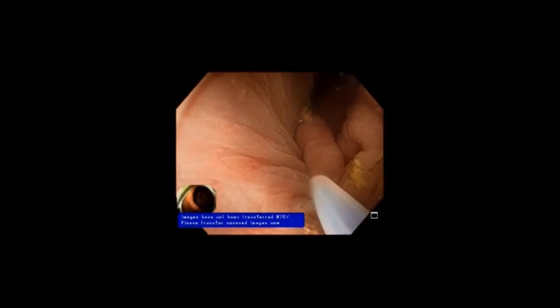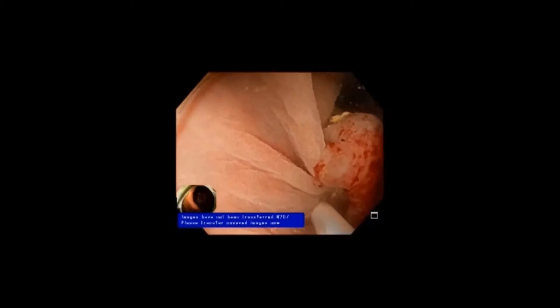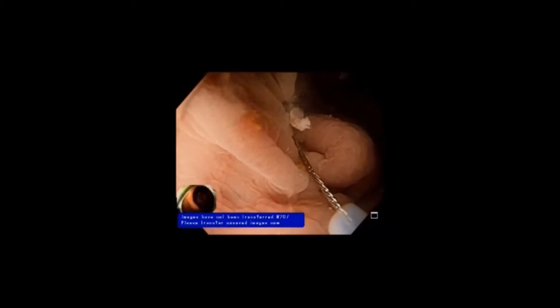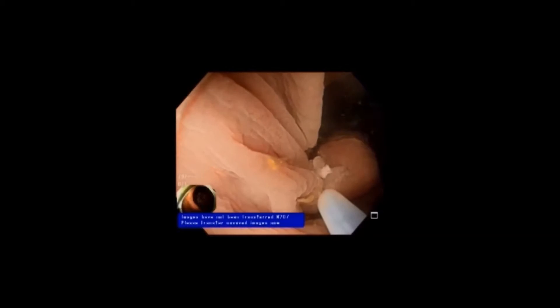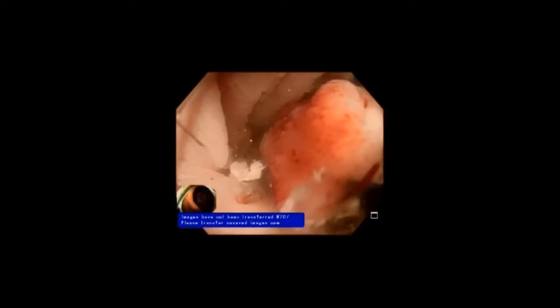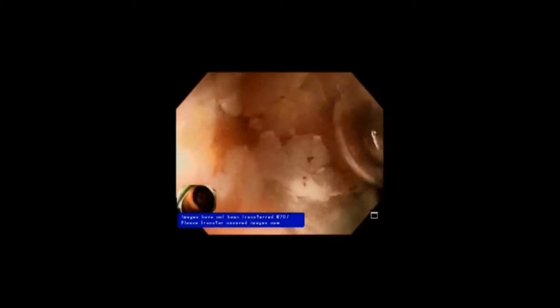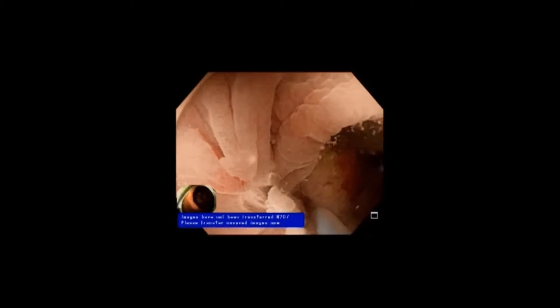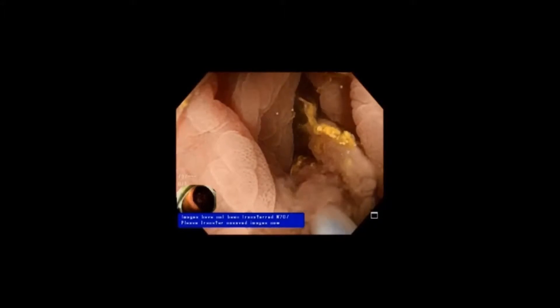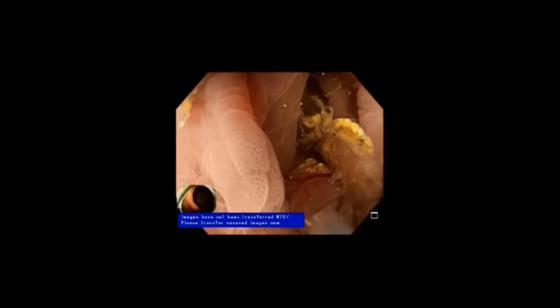Moving to a slightly larger lesion in the ascending colon — please notice that the bowel wall with the underwater technique looks relaxed. The folds look relaxed. The polyp and the submucosa seem to move into the center of the lumen and float on their own, which I think is important to the safety of the technique. We are removing this lesion piecemeal, but Ken has described removing 2 to 4 centimeter lesions en bloc using a 33 millimeter snare underwater. The feasibility of that is probably because with this technique the lesion doesn't get bigger — when you do submucosal injections, sometimes lesions will double or more in size. That doesn't happen underwater.